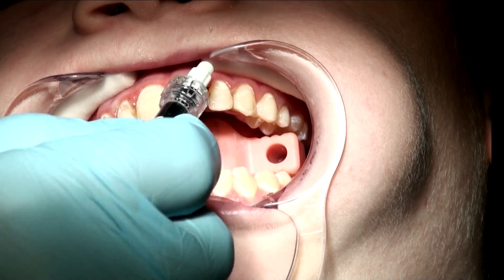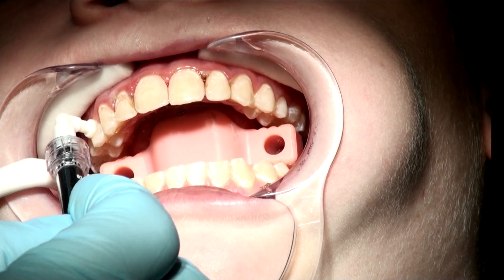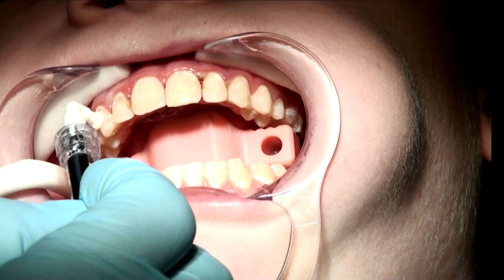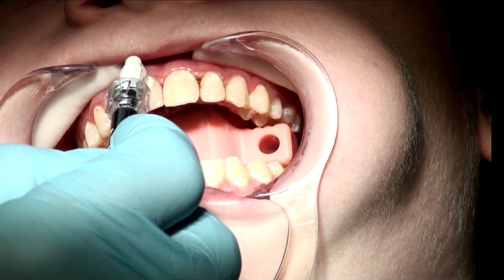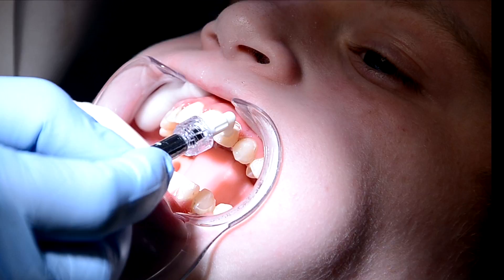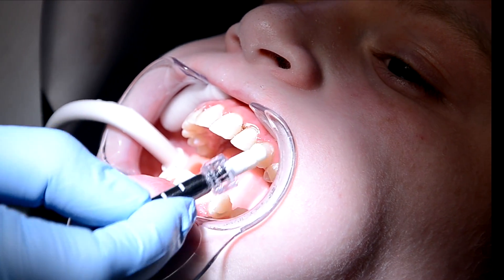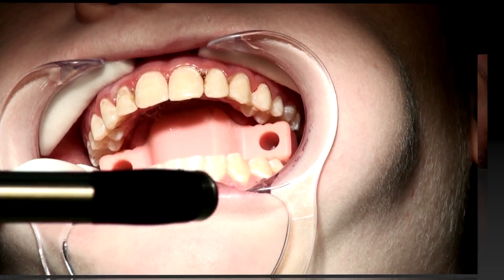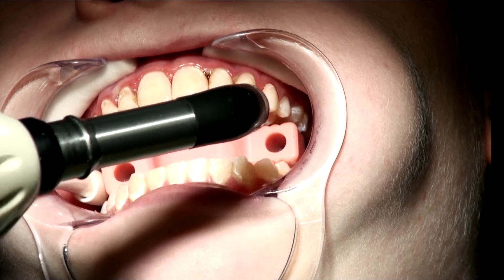I like to apply it and go back over it. I've even found that if some of the white spots are starting to be classified as caries, the Icon allows time for the patient to get to see their dentist prior to having the tooth filled, if necessary, without the caries lesion becoming more severe. I'm going to light cure for 40 seconds, and I'd like to light cure each tooth individually.